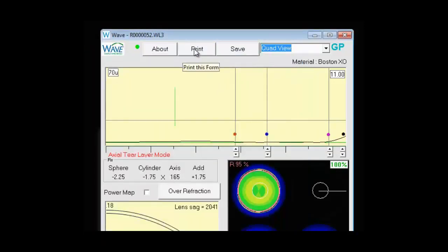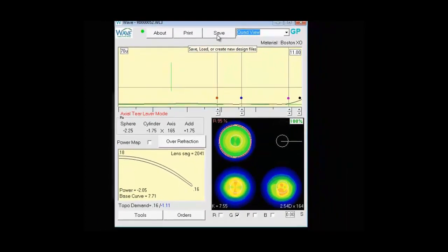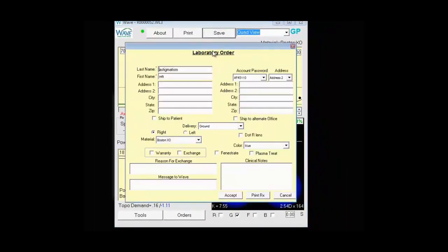Print will print the screen as you see it. Save. If you click Save, it will open up the lab order form. And here's where you can enter patient information if you want to ship to the patient. Your account information if you want to ship to a different office.